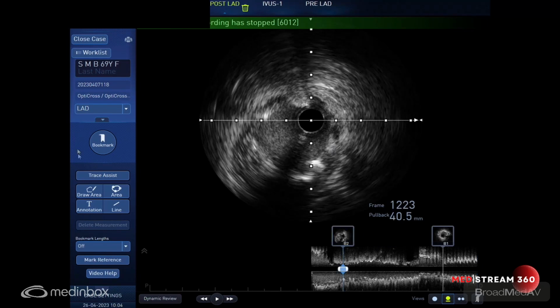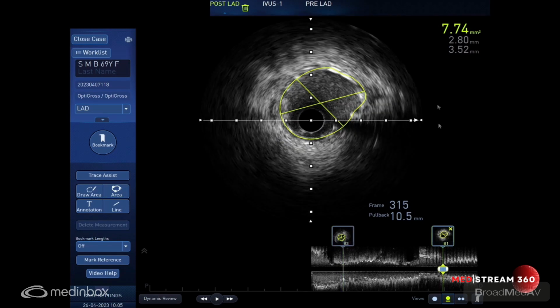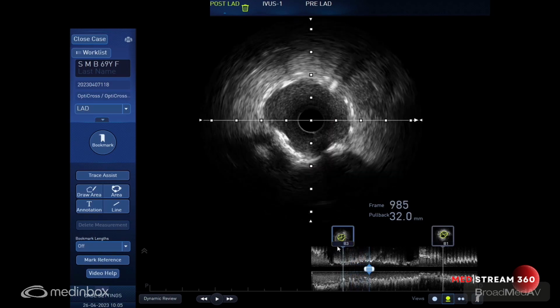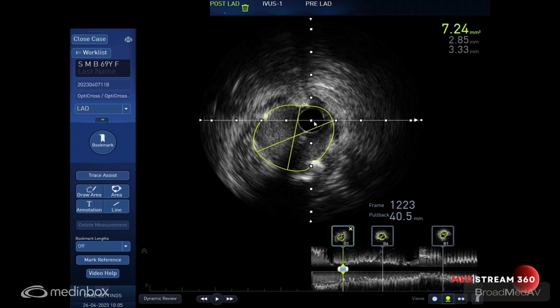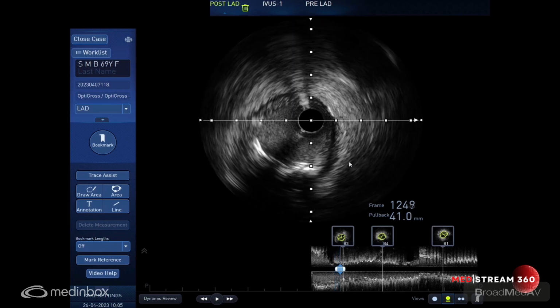So coming to the measurements, let's take some measurements now quickly, and then we'll decide whether to do anything for the proximal part. So we got a good distal area of 7.7. Can we have the minimal stented diameter, sorry? Yeah, maybe that's the place where we have the minimum stent. That was where it was very calcified. It is all about 7.3, 7.5, 7.4, probably 7.5. And the proximal segment alone, just a 3.5 balloon at nominal pressure. So we'll just do a 3.5 for the proximal because we feel it can be done a bit better. And then we are done with the whole thing.